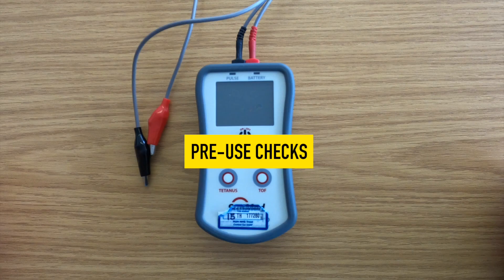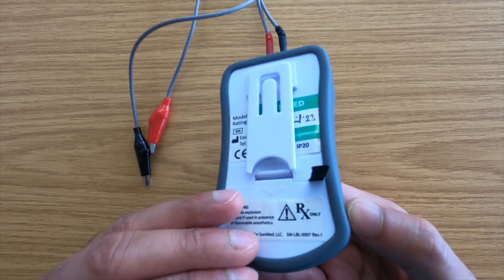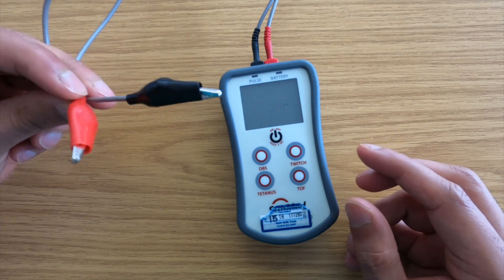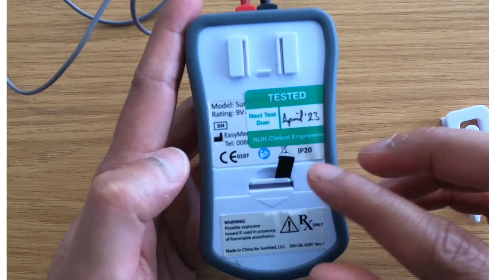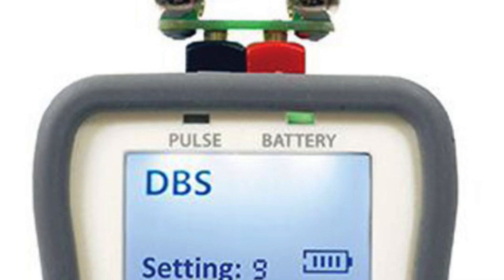Pre-use checks. Before using the device, check for obvious signs of physical damage to the equipment and provided connectors. Check the service sticker to ensure that it is within its service period. The battery LED is steady green when the device is turned on. A battery replacement is needed when the battery LED flashes during use.